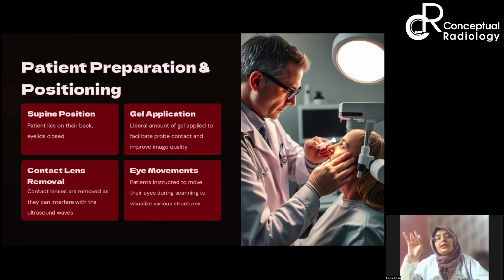Another important thing is that don't move your neck, don't move your face. Your neck should be still, and only your eyes should be moving within your sockets. So ये सारे instructions, the different types of movements that they have to do, whether sideways, ऊपर नीचे, or 360 degree rotatory movements, everything should be instructed well before asking them to close the eyes.